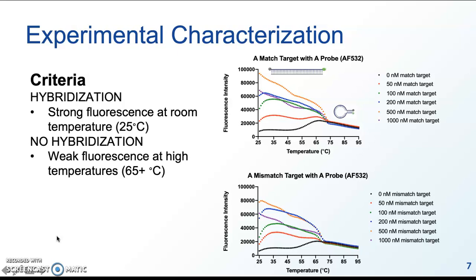Likewise, a single-stranded synthetic target and a single-stranded molecular beacon bind together at room temperature and spontaneously dissociate at high temperatures. We can take advantage of these binding properties and measure the fluorescent signal at room temperature as a signal that the molecular beacon is open and bound to the target. Then, when they dissociate, the beacon closes and returns to its base level of fluorescence.